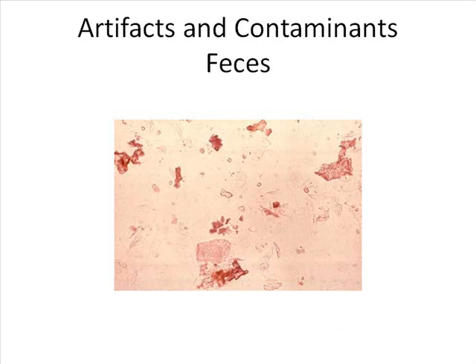Now, artifact. You can see some urines that have huge amounts of artifacts, and sometimes it is because the nurse was very lazy. The patient actually defecated in the bedpan and urinated in the bedpan, and they pour off the urine. Because in their mind it's like, well, you can still do a urinalysis off that urine in the bedpan. And this is the kind of stuff you'll see.